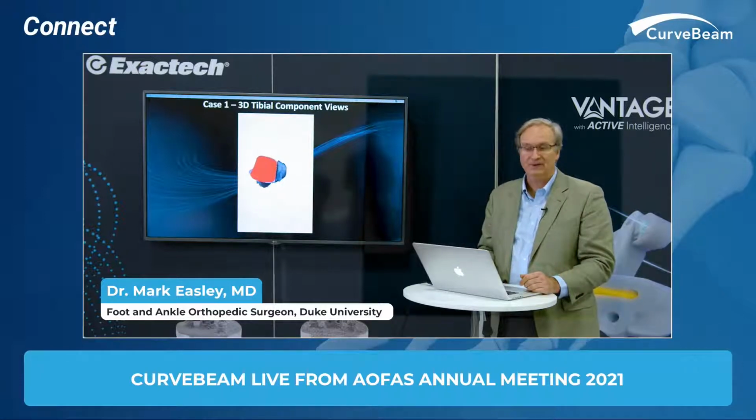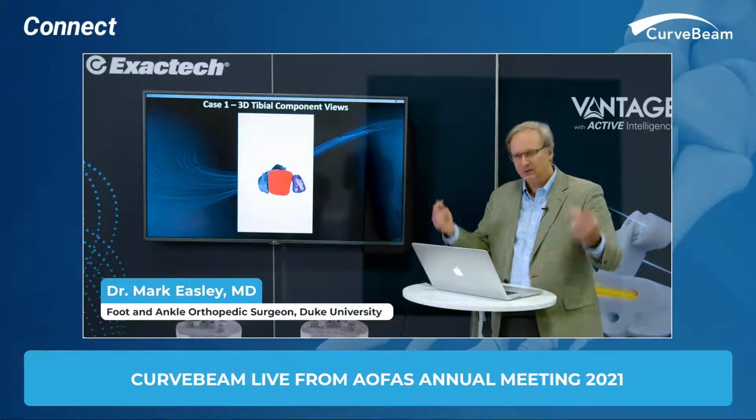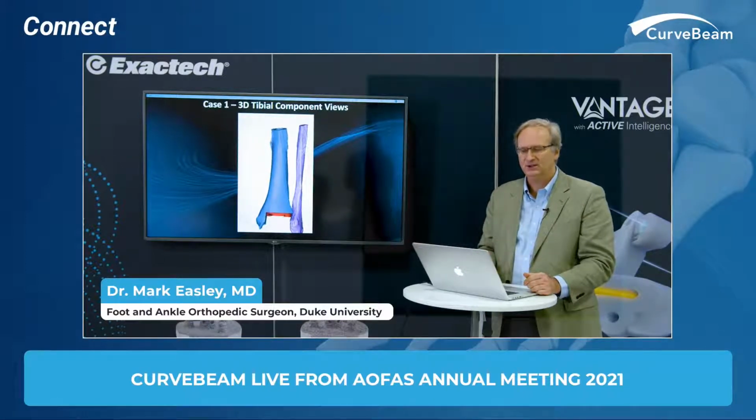And I've had cases before where I was upset with the 3D Systems team. I said, this is way in external rotation. This is wrong. So we went back, we talked through it, looked at it. It was all on me. I signed off on it. I had told them that I wanted that component in too much external rotation. So it's a very accurate system, but I do all the planning ahead of time.